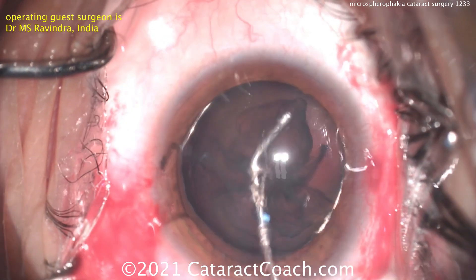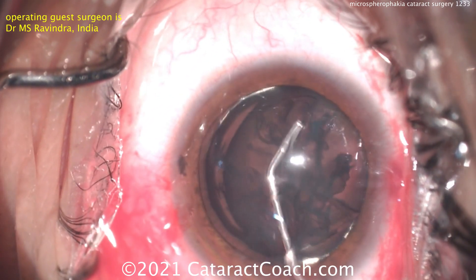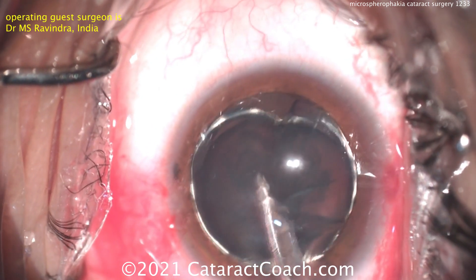A little bit of balanced salt solution to get a little hydrodissection. Fortunately, this lens nucleus is relatively soft and should be able to be aspirated quite easily. Now the key here is figuring out what we're going to do for capsular support — how are we going to place a new lens in?